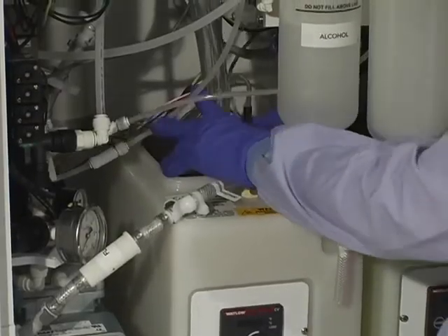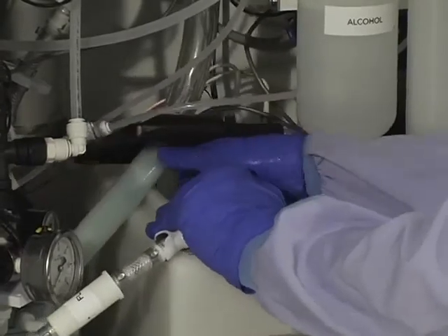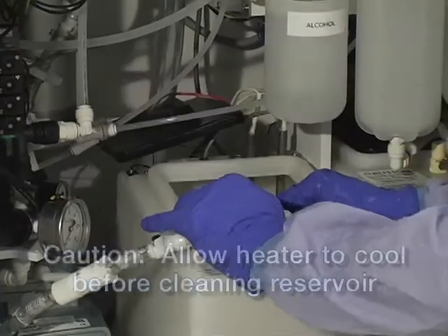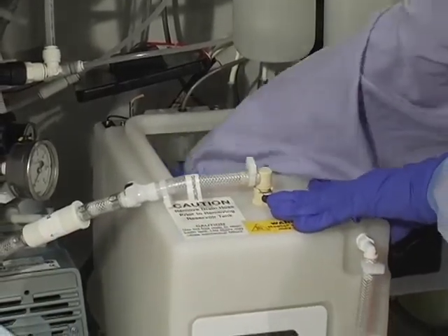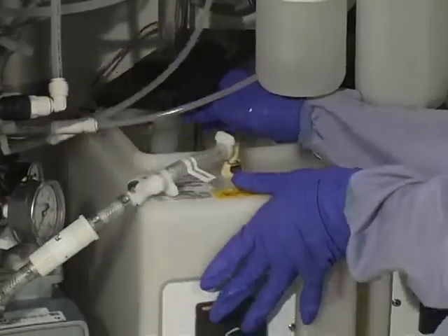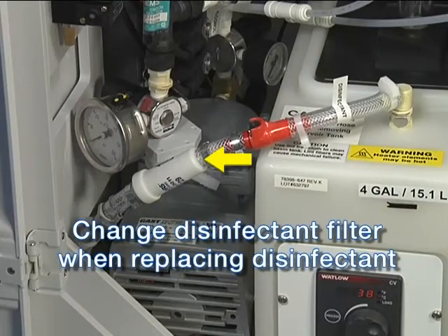The next step is to wipe out the disinfectant reservoir with a lint-free cloth. Remove the basin drain hose from the reservoir. Slide the reservoir out and remove the cover. Make sure the heater has cooled sufficiently. Wipe the reservoir interior surfaces with a damp, lint-free cloth. Replace the cover on the reservoir and slide it back into position. The disinfectant filter must be replaced every time the disinfectant is changed.